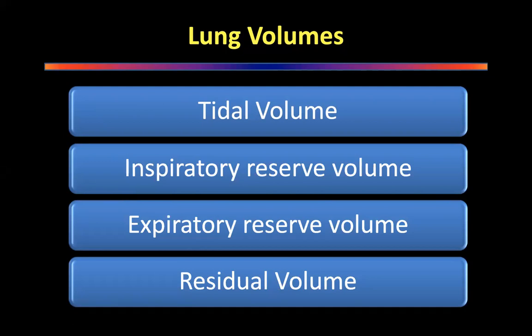Very often on the table we say to the anesthetist, reduce the tidal volume when we are operating, when the lung is coming in your way. But do you really understand what tidal volume is? That is why this graph is very important, because it makes you understand what exactly is the change that you're seeking in the lung.